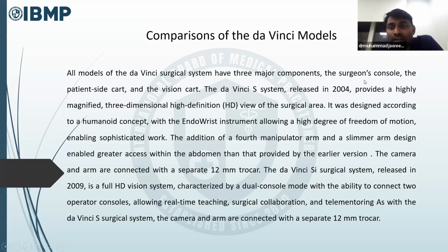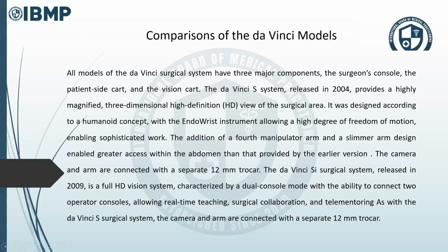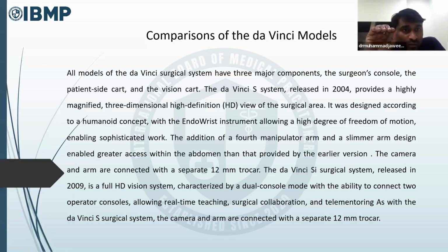So the addition of a fourth manipulator arm and a slimmer arm design enabled greater access within the abdomen than that provided by the earlier version. So previously, hello? Yes, sir. Is it audible now? Did you understand the point previously?